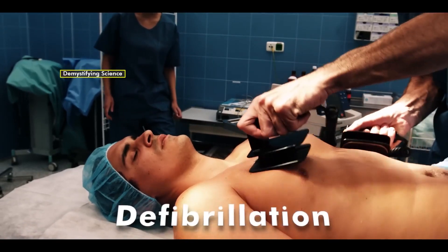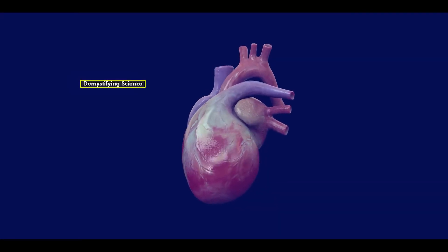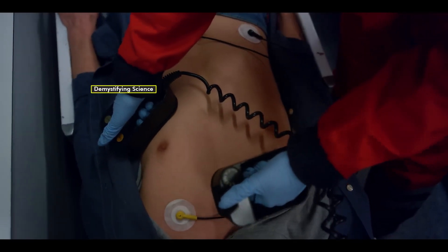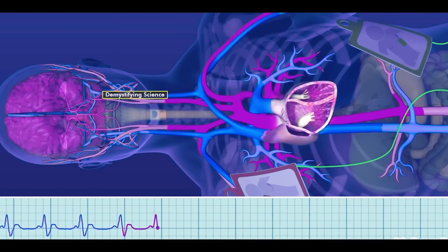Defibrillation is a treatment used in emergency conditions to correct life-threatening arrhythmias or abnormal heart rhythms. Through defibrillation, an electric shock is administered to the heart, normalizing the heartbeat and allowing it to function again.